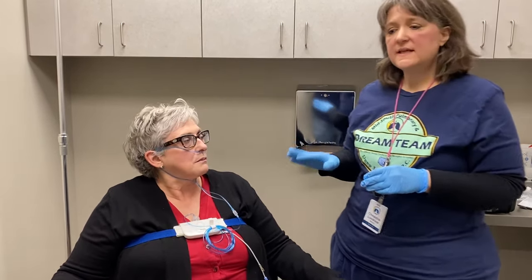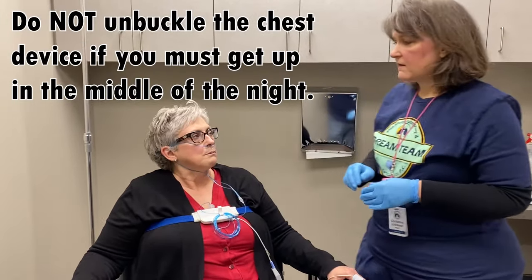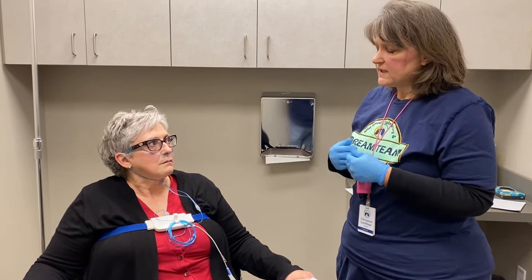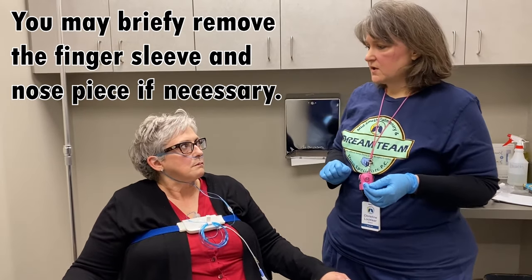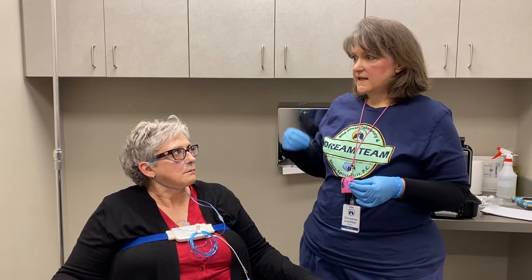If during the test you need to get up to use the restroom or get a drink of water, the main thing to remember is to not unbuckle this belt because it is the on-and-off switch. If you unbuckle it, it's going to stop your test, and when you buckle it back in it's going to start another one — we can't put those little pieces together, so we won't get that long study the doctor needs for a good diagnosis. However, you can briefly take off the finger sensor if you need to wash your hands, and briefly take off the nose sensor if you need to blow your nose — just keep it to a minimum and try to remember to put it right back on.